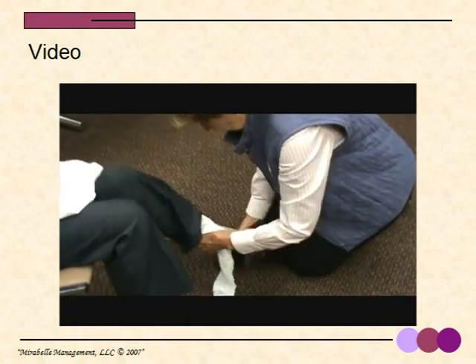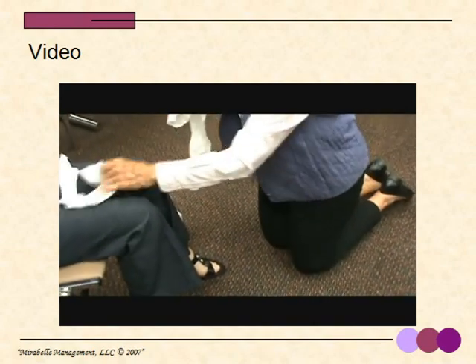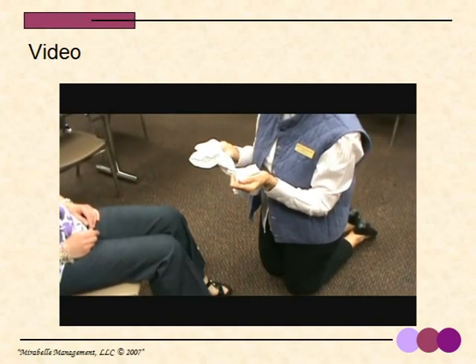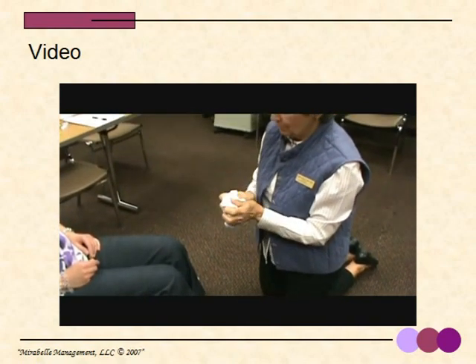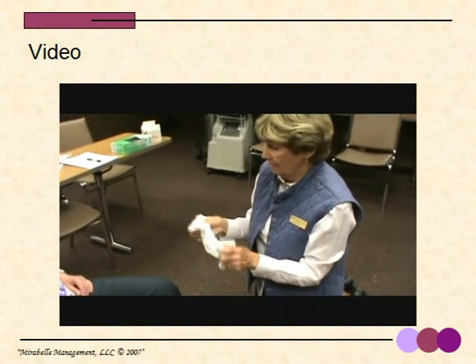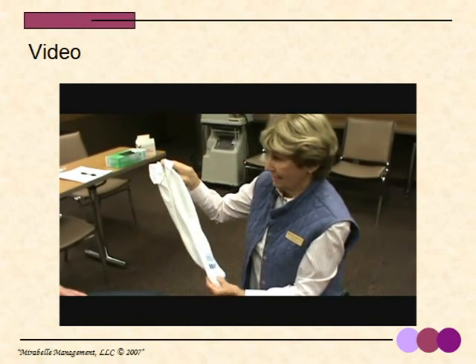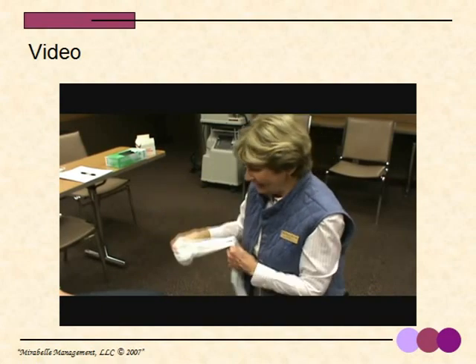Slip your shoe back on so you can make one last trip to the refrigerator. And then I'm going to take your stockings probably into the bathroom. I'm going to get some warm soapy water, and I'll wash them out, and I'll rinse them in some warm water and probably wrap them in your bath towel to dry them, and then just hang them up on your bath towel. They're all set to go for the morning. Thank you. You have a good day. You too.